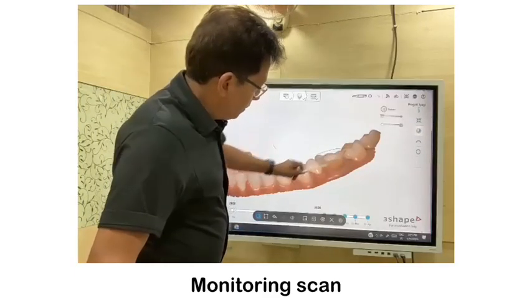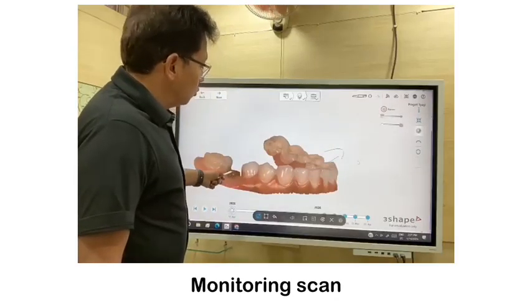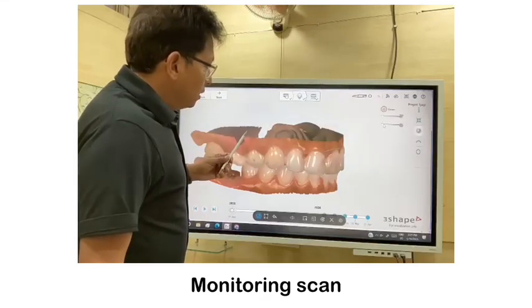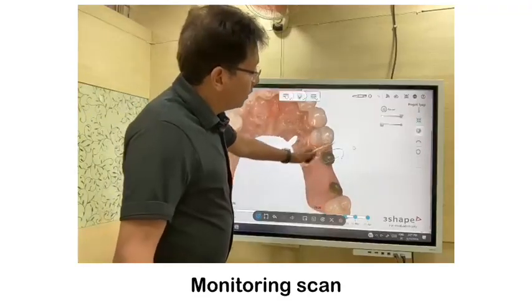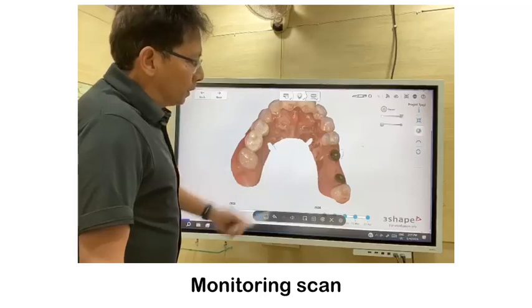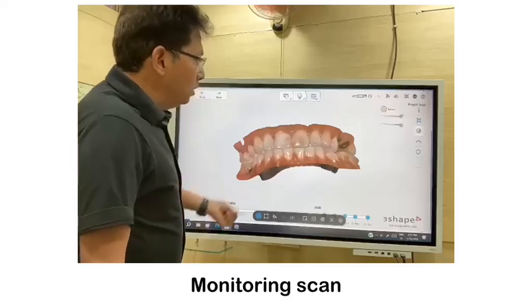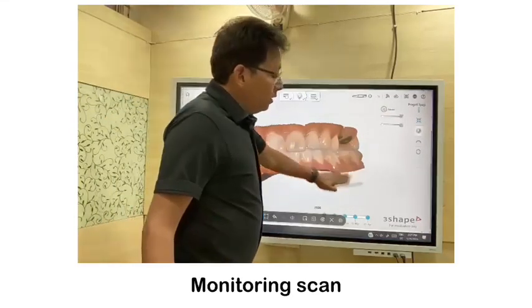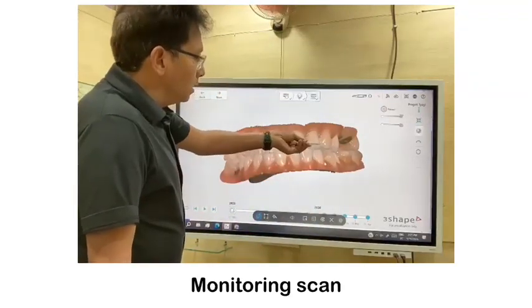I placed an implant on this because the root canal tooth broke one day, and she had got a root canal done many years back. Then she had 2 zirconia crowns here, but under the zirconia there was a damaged tooth, so we had to remove them and place the implants. Once we placed the implant, we gave her one option. She was fed up of one tooth treatment after another.